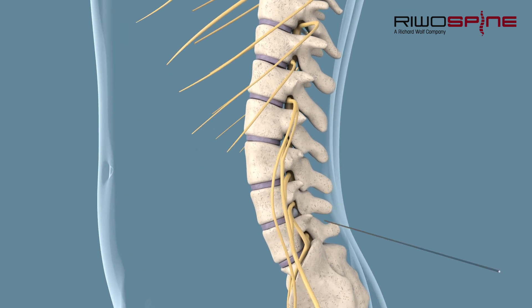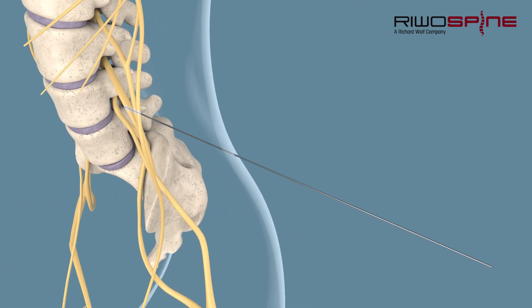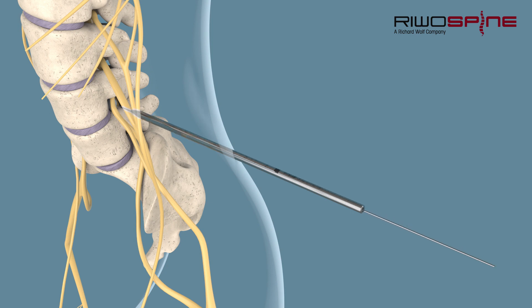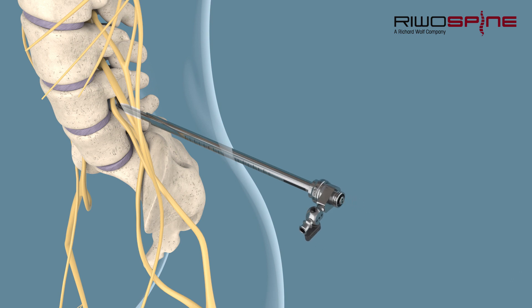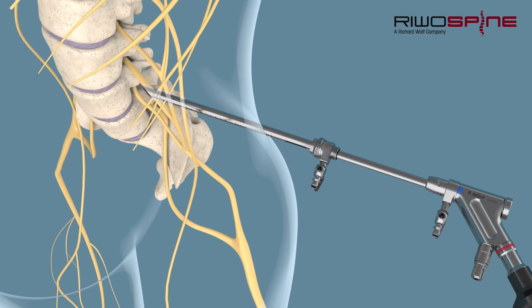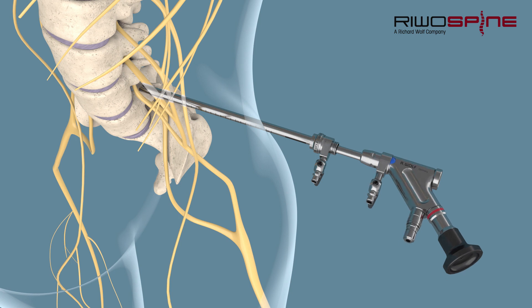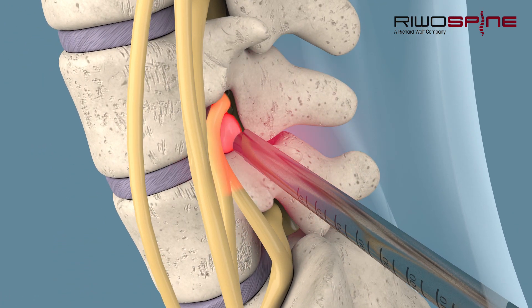First, a guide wire is used to ensure the correct positioning of the instruments. Thanks to special instruments and devices such as the dilator and working sleeve, this procedure offers the most minimally invasive approach compared with conventional methods. An essential component is the endoscope, which guarantees optical control of the treatment at all times. This allows the procedure to be performed safely and least invasively.